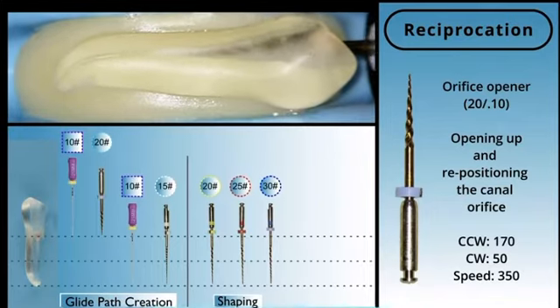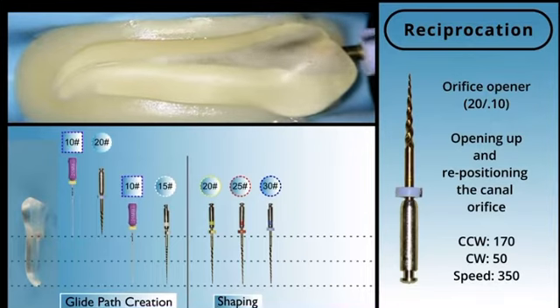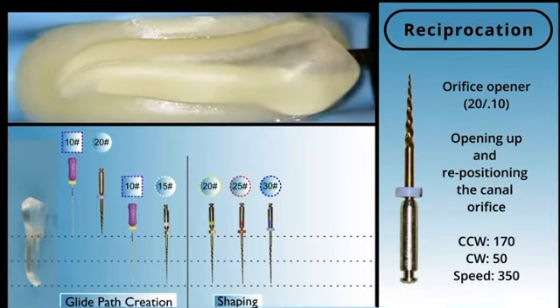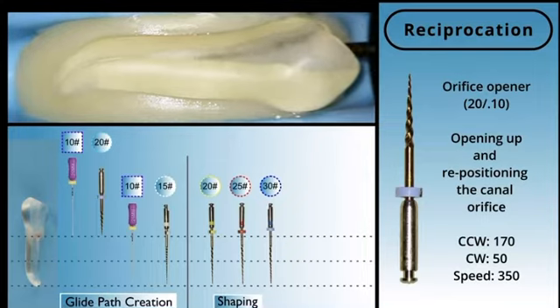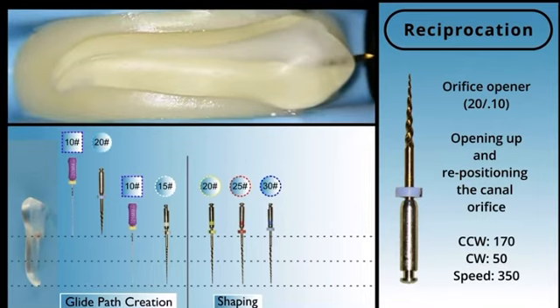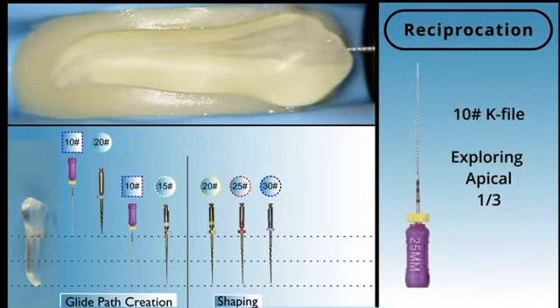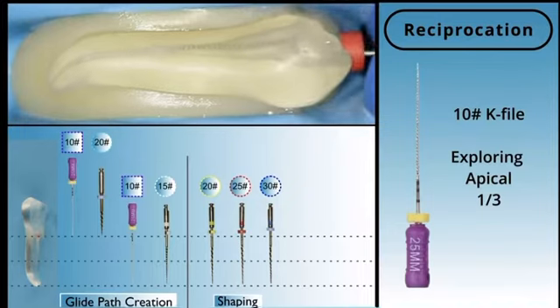All of the file systems are using the same setting for the reciprocation, and the counterclockwise angle is 170 degrees and the clockwise angle is 50 degrees and the speed is 350. This is why it's important that you have an open source endodontic motor.